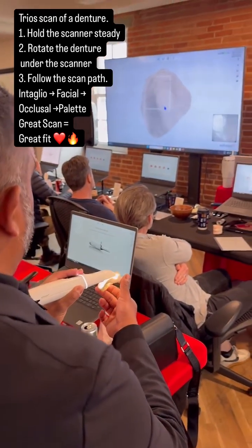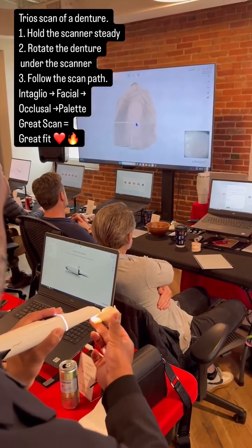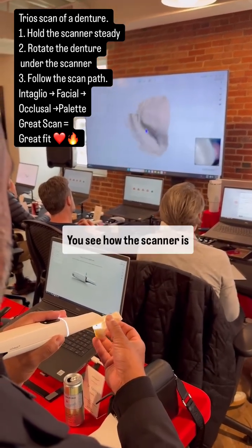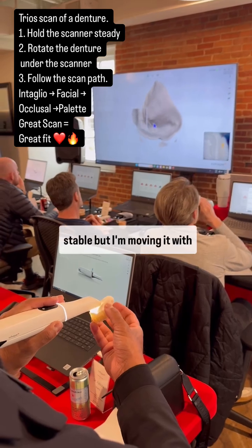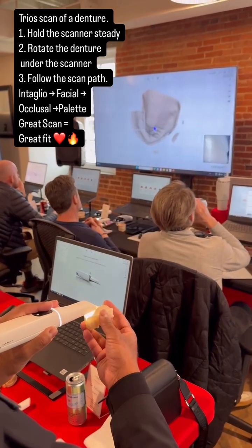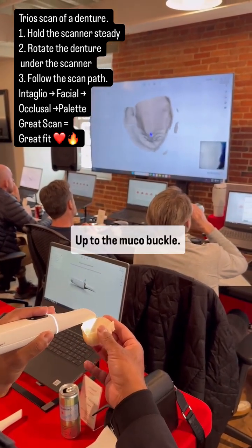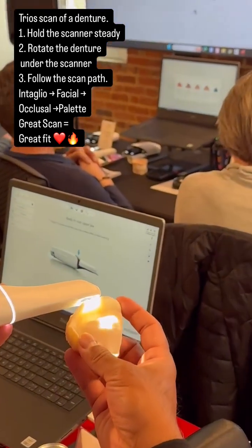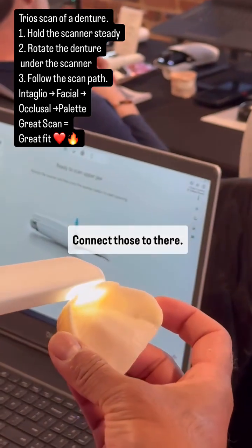Concentric circles. Get up to the ridge. You see how the scanner is stable but I'm moving it with my fingers. Up to the mucobuccal roll. On to the buccal. Connect those to there.